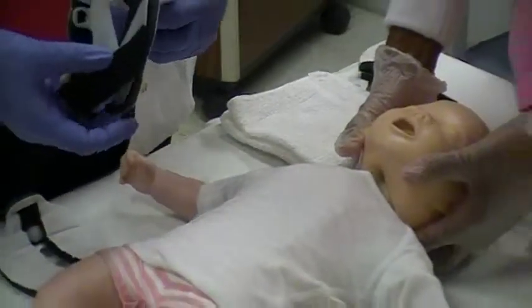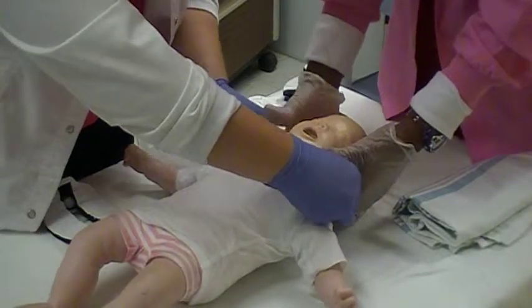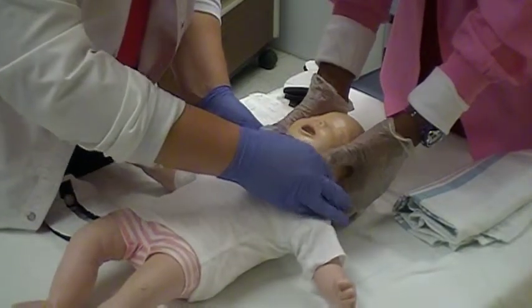With the child in neutral alignment, slide the front panel of the collar up the neck and properly position the chin support. The front of the chin is flush against the chin piece.